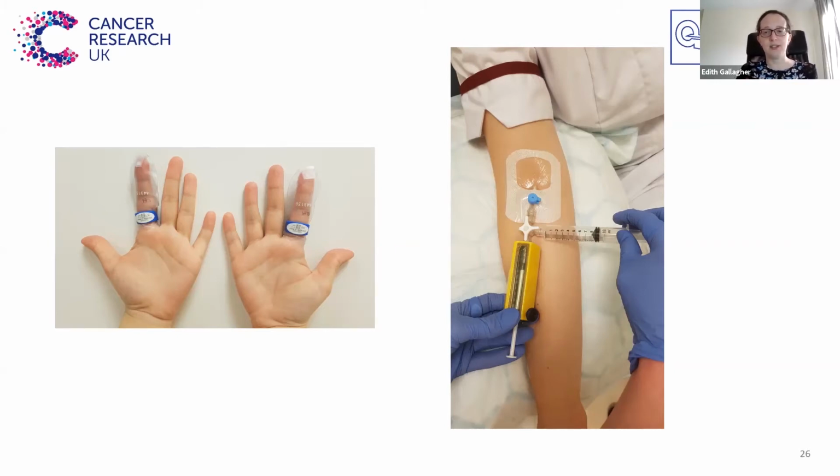On the right, you can see a simulation of a radioactive injection. This requires a certain amount of skill, as the shielded syringe containing the radiopharmaceutical can be quite tricky to attach and detach from the cannula due to its weight, and to make sure that the radioactivity doesn't drip anywhere. I've always said if I had an additional 3 hands, it would make injecting so much easier.